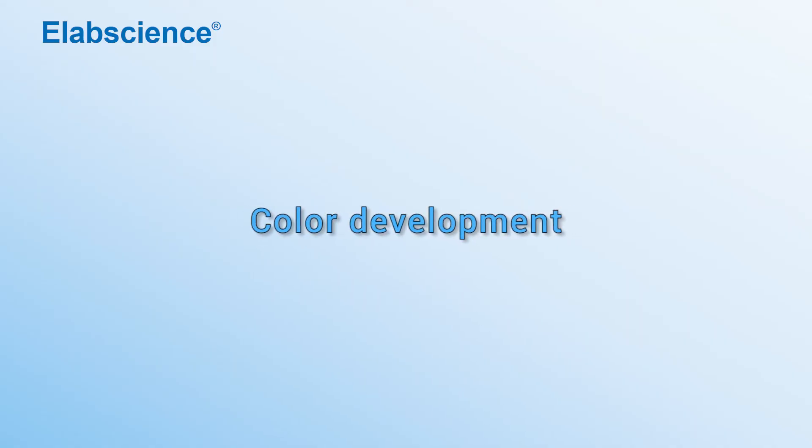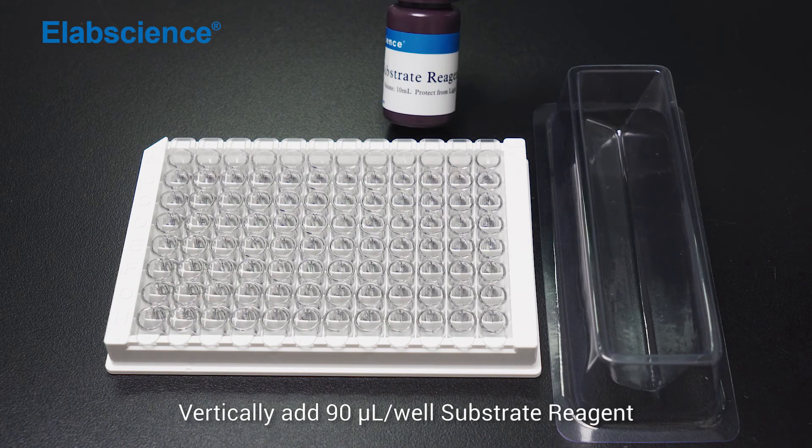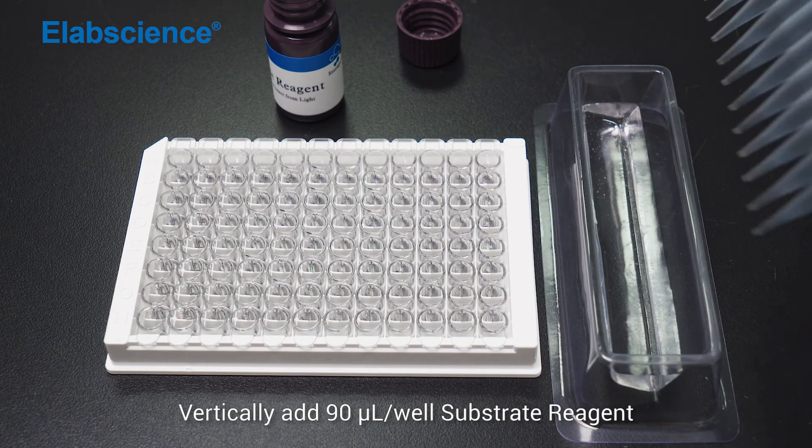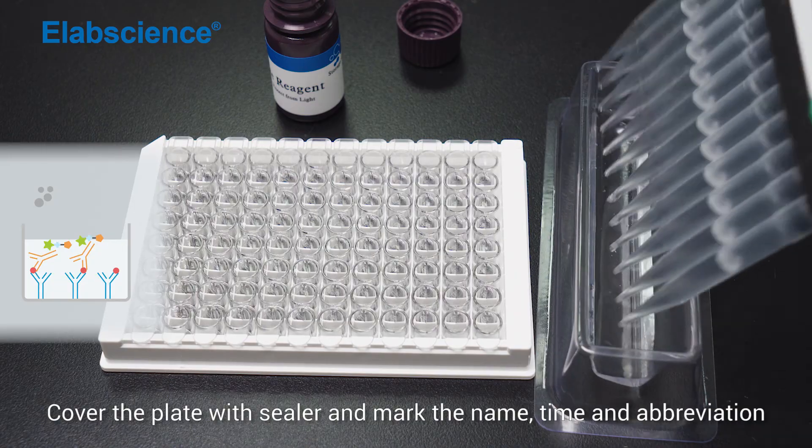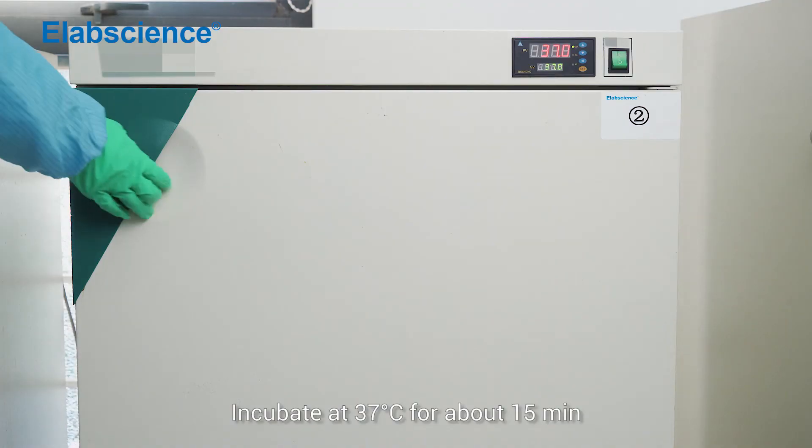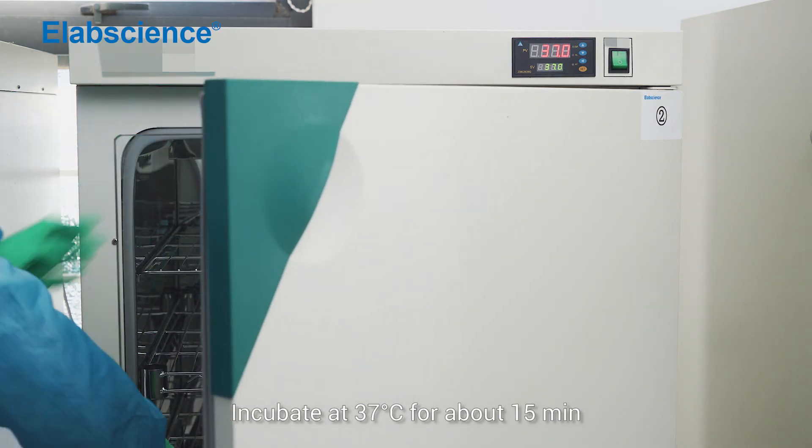Color development. Vertically add 90 µL per well substrate reagent. Cover the plate with sealer and mark the name, time and abbreviation. Incubate at 37 degrees for about 15 minutes.